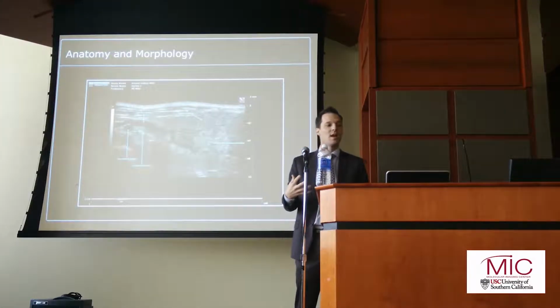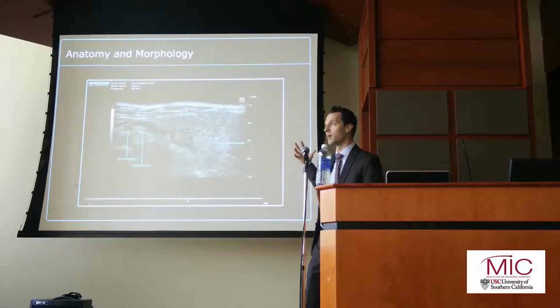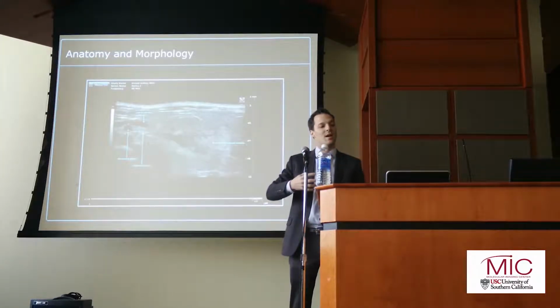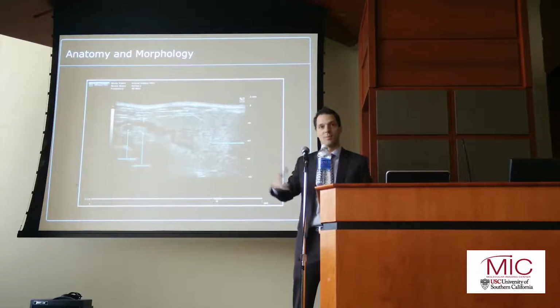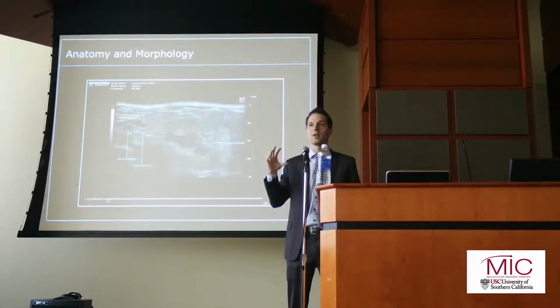So you really get a good sense of not just the high resolution, the anatomy that you can see, but also the real-time aspect. You can see the motion of the animal breathing, you can see the pulsation of the abdominal aorta, and so on.